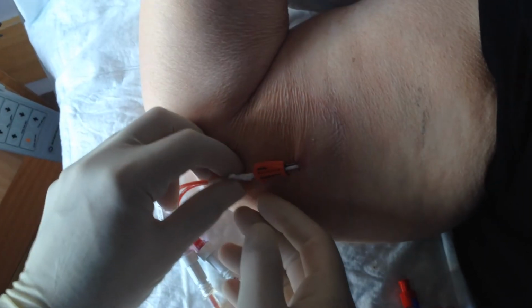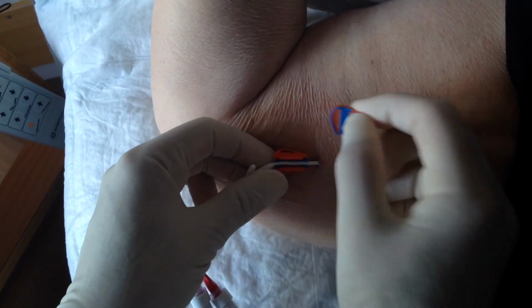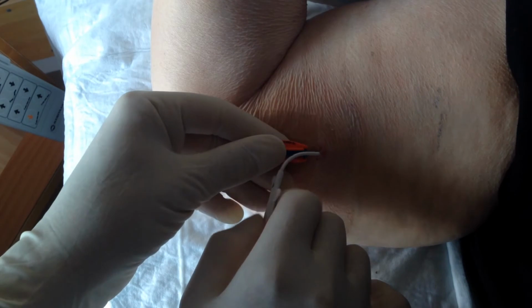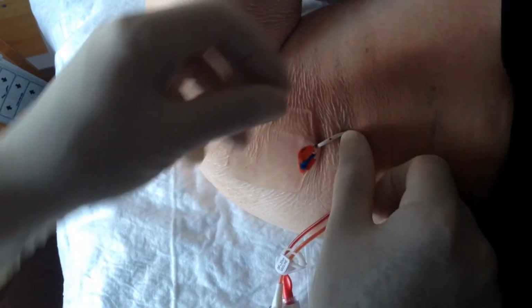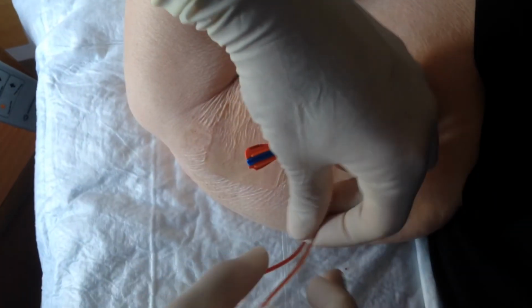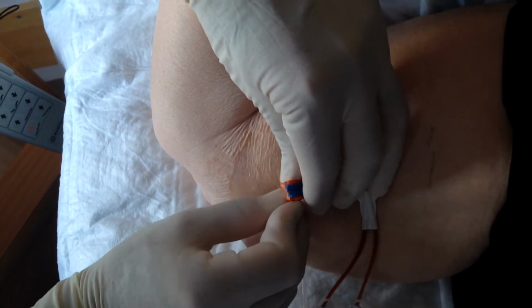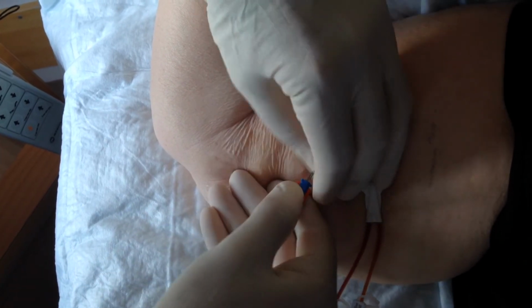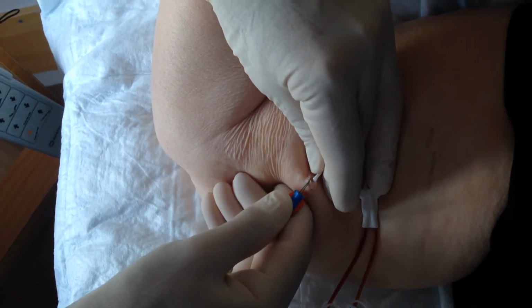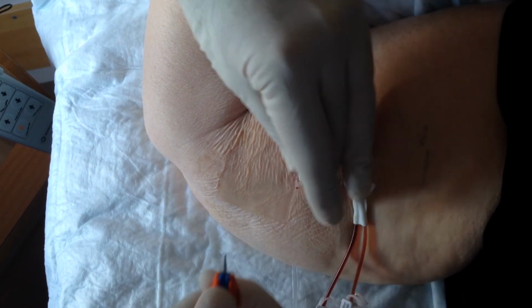Okay, to remove the SecurAcath, you first open the fixation device like this. Then you can take out the catheter to the other side. You can free your hand and do this way. And then you push those two together. And now it should be able to remove the device without any problems.